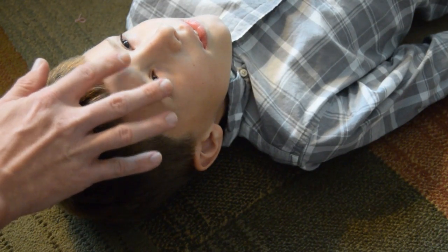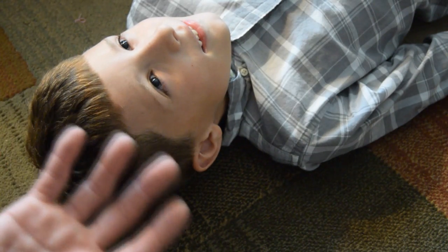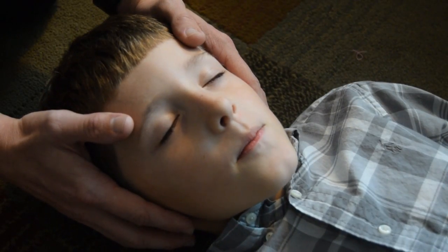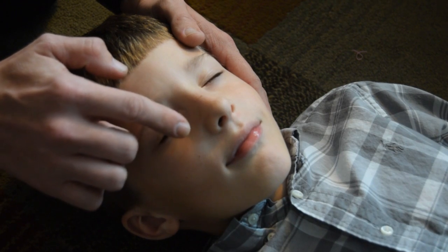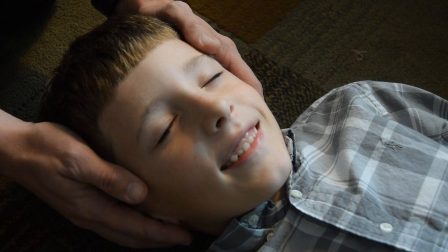So if the patient has lost their eye reflex — like he's blinking his eyes right there — then they typically do not have an intact gag reflex. There are two ways to determine if he has an intact gag reflex. One, we take our finger and we touch his eyelashes. See his eyelashes flicker like that? That's letting me know that he still has an intact gag reflex.